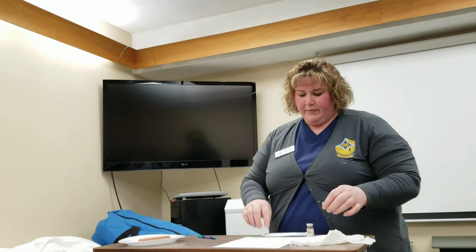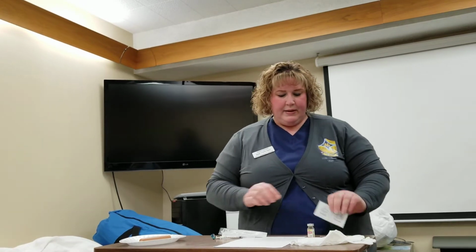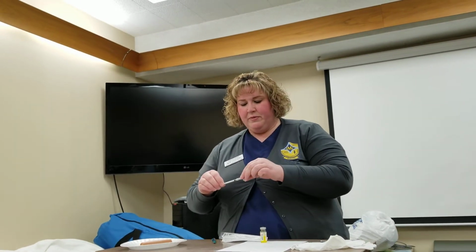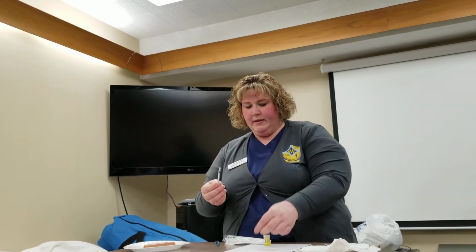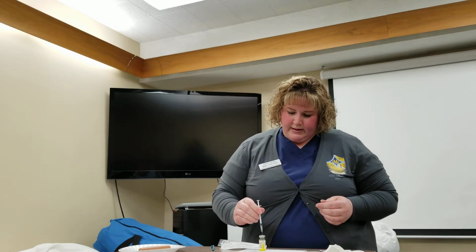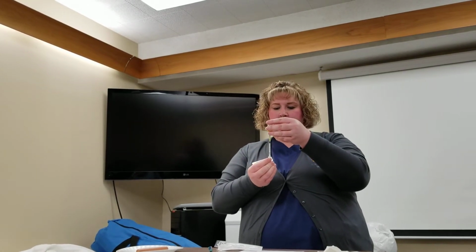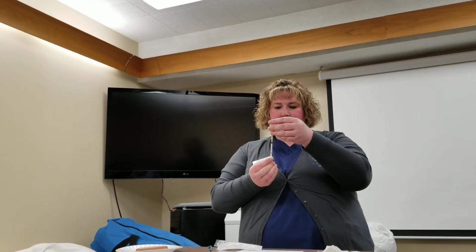On a clean surface, I am going to open my syringe, and I'm going to clean the top of my vial. I'm going to remove the cap, and I'm going to draw in 1/10 of a milliliter of air, insert that into the medication vial, and inject the air. Then I will turn it and draw out my 1/10 of a milliliter of medication.